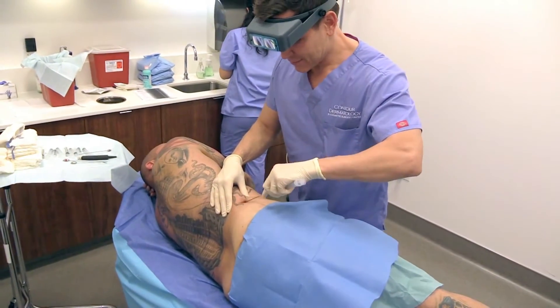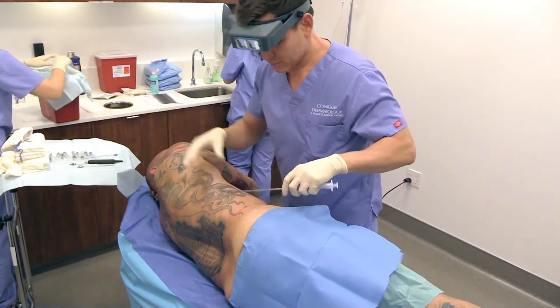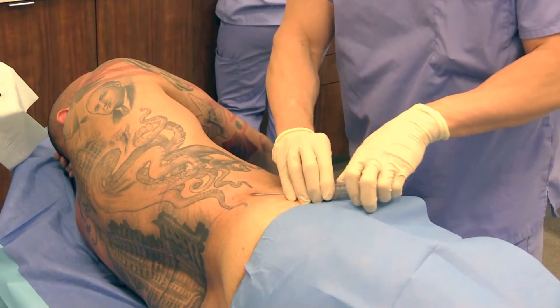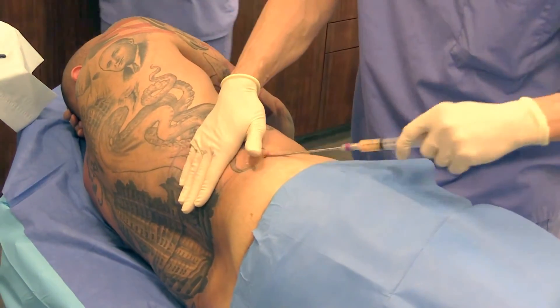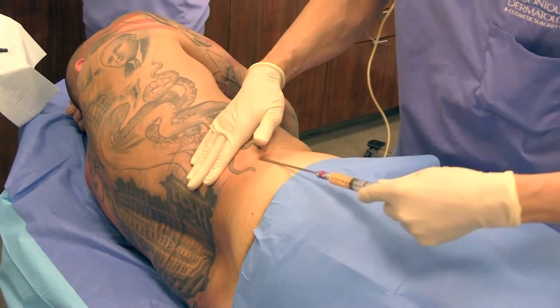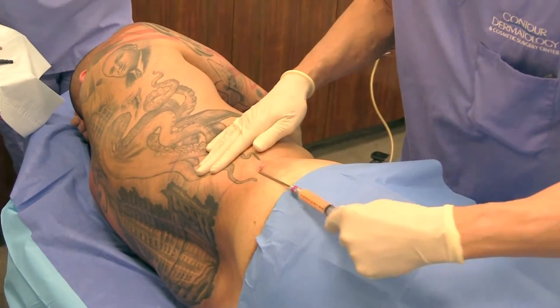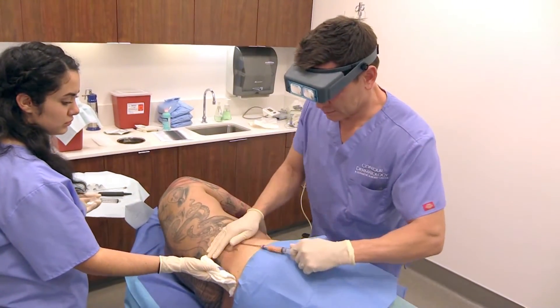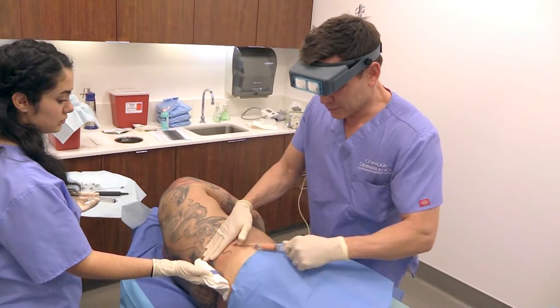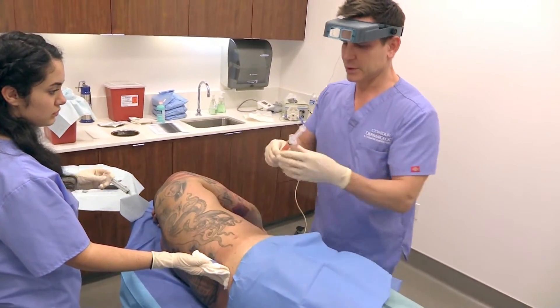So now we're going to start the harvest process. With this we just use a syringe with a little pressure. This is a bit of a challenge because our patient had liposuction, so there's not as much fat and the quality won't be quite as good because he's so lean. When you're a super athlete you don't have great quality of fat typically. We use the syringe because we want to harvest the fat under low pressure. I've been doing this procedure for about 15 to 20 years, so I'm comfortable using these — some people may use higher-tech devices, but this is still a very common way to harvest fat.